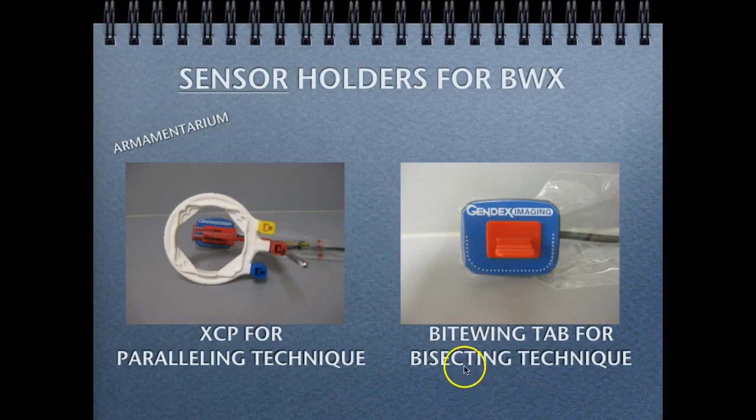Now, when you use a tab, we say that we're using a bisecting technique. And the bisecting technique, you really have to have a good understanding of the position of the image receptor to the patient's teeth, and then the PID to the facial landmark and the alignment, which we'll look at in another slide presentation, of the image receptor, the teeth, to the PID.